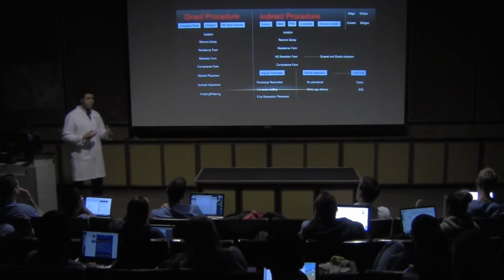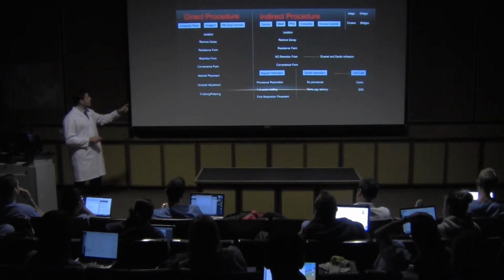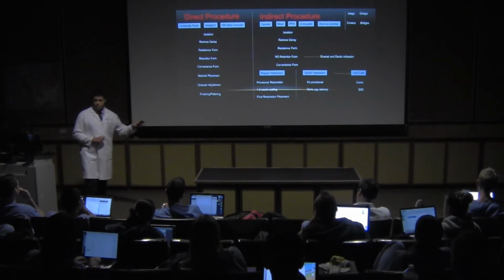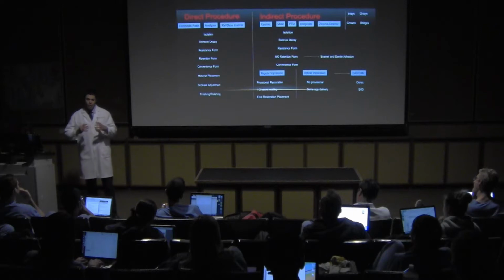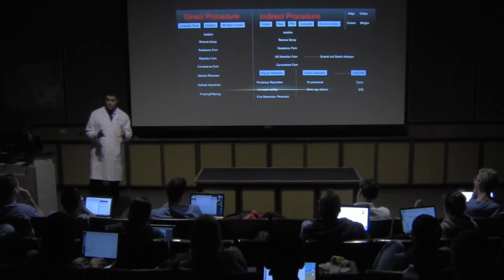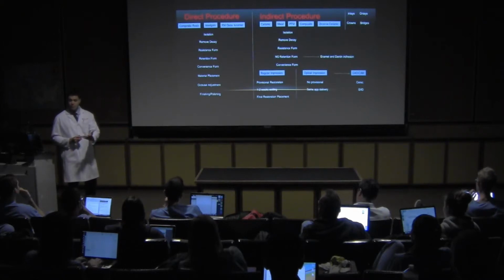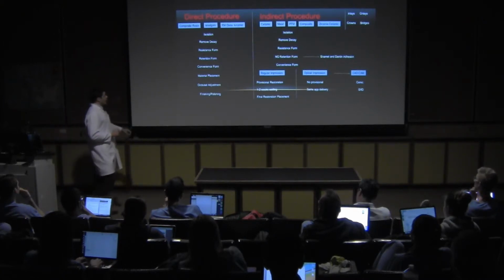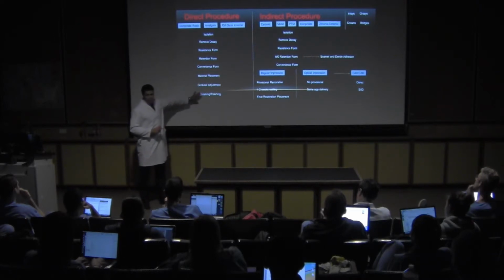I'm going to prep this tooth to have a resistance form, the retention form. Okay, all this I'm doing in the time that I'm preparing this tooth, and the convenience form to receive this material. All right. And I'm going to the material placement, go to occlusal adjustment, and do the finish and the polishing.